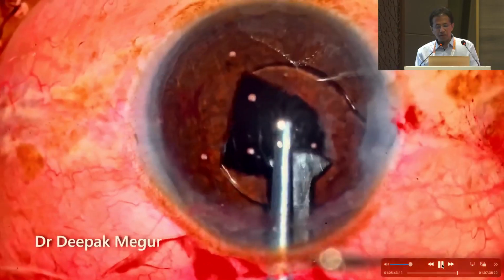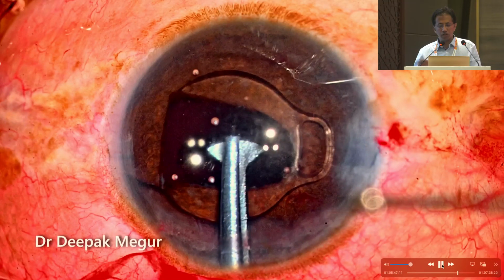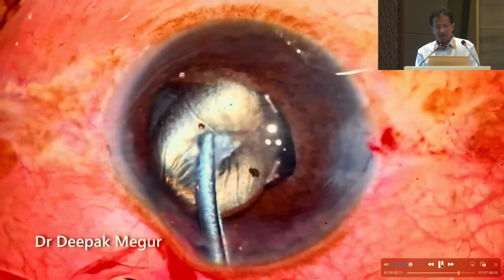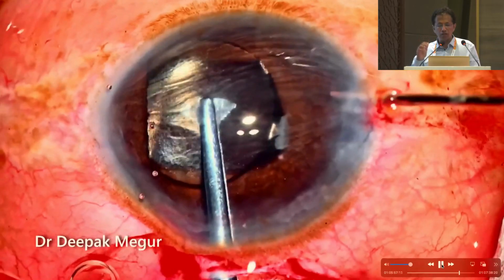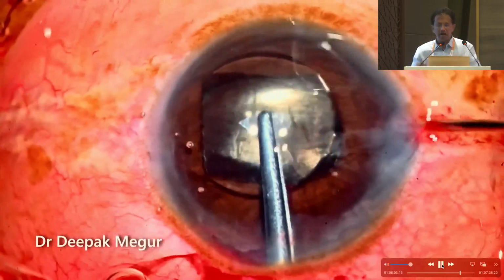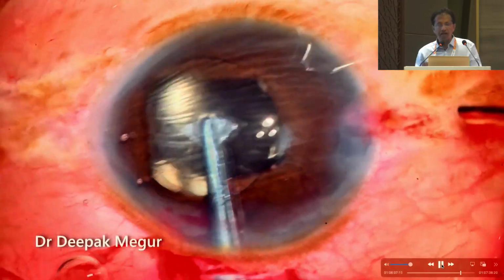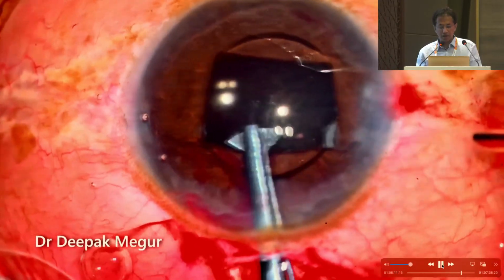So that is one of the major concerns for all the beginners: how do I know that the enclavation is done properly or not, and that I may drop the lens. So this is one small trick. Again, holding the lens at that position ensures that mentally you can still visualize where the notch possibly is. So just beside where it is, you can do a notch so that the haptic slips and the iris goes in between and enclaves. Again, you just move and see that both the iris ends are enclaved properly.